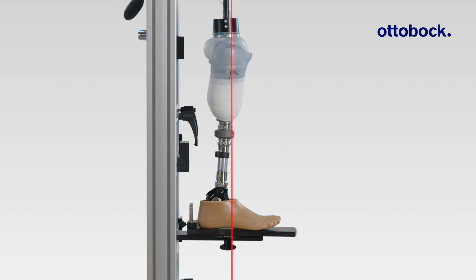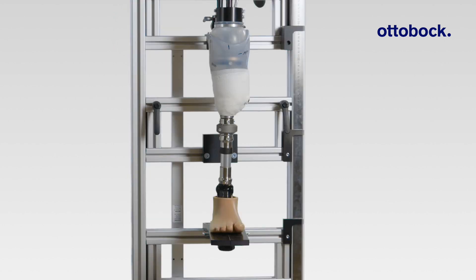Position the alignment reference line so it coincides with the alignment marking on the footshell. Make sure that the socket reference point lies on the alignment reference line and that the socket flexion angle is correct. Now connect appropriate structural components. In this example, the test socket was pre-configured with the Ottobock quick-change adapter. Observe the adduction and abduction from the front. Set the external foot rotation to approximately 5 degrees and reference the alignment mark on the inside of the footshell. Ensure the alignment reference line runs along the lateral edge of the patella. Secure all allen screws before starting the static alignment.